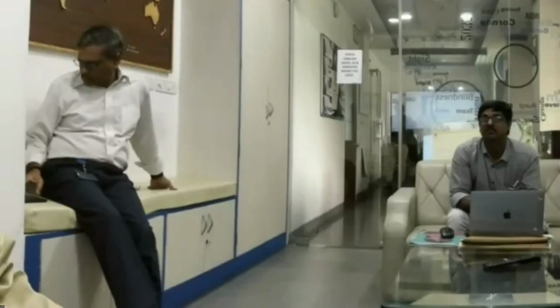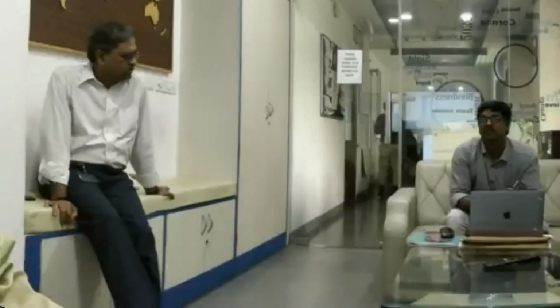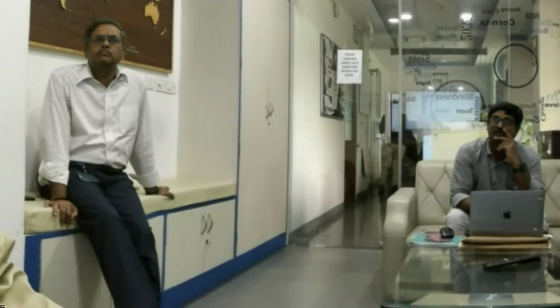I just want to ask one thing. Here we are doing a whole globe excision. Sometimes the donor comes back seropositive, and then we have to discard the media if we take the rim. So is it acceptable? First we get the whole globe.